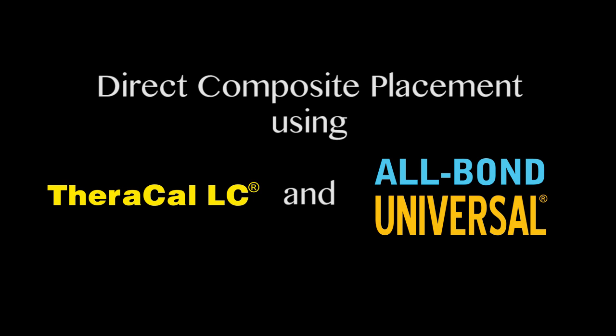A step-by-step technique is presented for a class 1 direct composite restoration using Theracal LC as a liner and All Bond Universal Dental Adhesive to ensure a durable bond and long-lasting restoration.